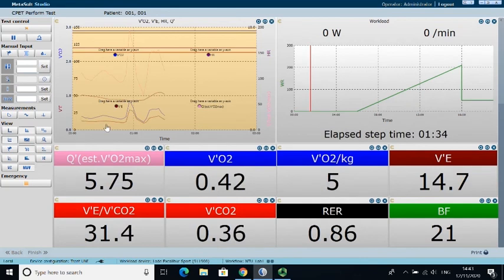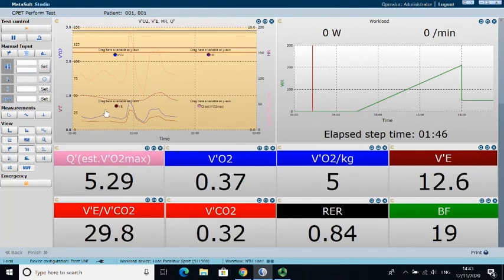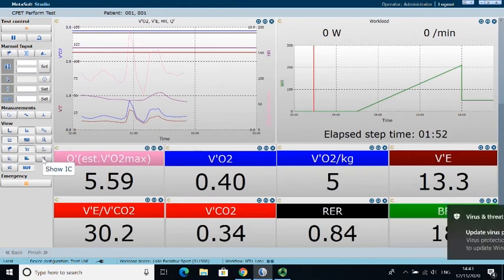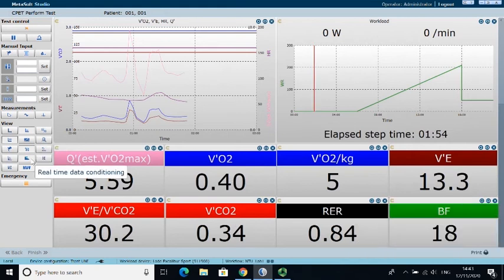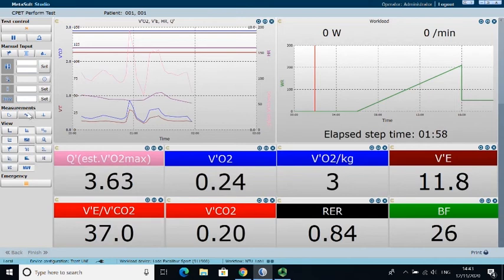Sometimes this one's quite nice because you can see the test progress, or you can see the test coming. It also gives the values nice and large, so it's often good if you're going to be showing the participants what the values are and explaining it to them. I like the one that I showed you originally, so I'm going to go back to that one. I think it tells you more information and shows you some of the important elements of physiology that are changing during the test. Essentially I'm just going through these different markers to show you how much you can really do with the software.